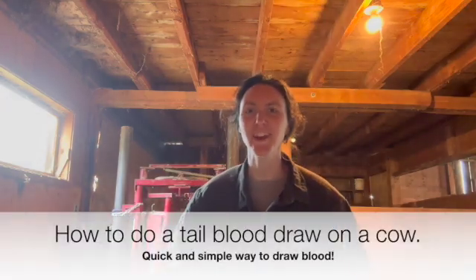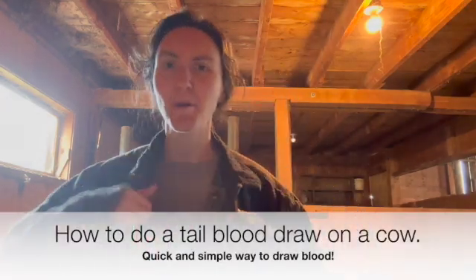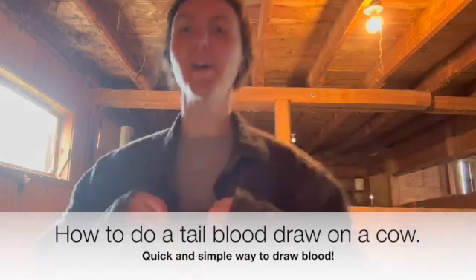Hi friends, Robin here from She's From Scratch and in today's video I'm gonna put you in my pocket — my little overalls pocket — while I show you how to blood draw from a cow.